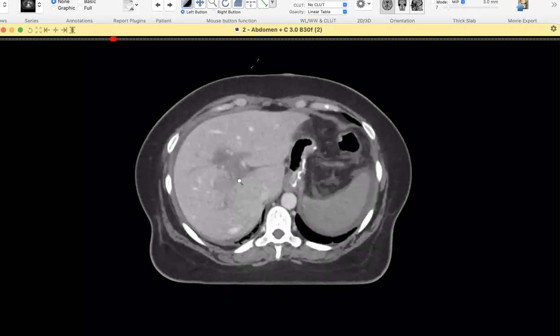Thank you, Dr. Wasif. Thickening and mesenteric congestion are not enough to say ischemic infarct. In case of bowel, you have to specify whether it is arterial or venous. If you get paper thin bowel walls, then it is going more towards arterial ischemic changes. Also, you'll have pneumatosis intestinalis when it is arterial. You don't have those things in venous ischemia. You just have this thickening and congested mesentery, almost watery appearance of the mesentery. Okay. Thank you very much.